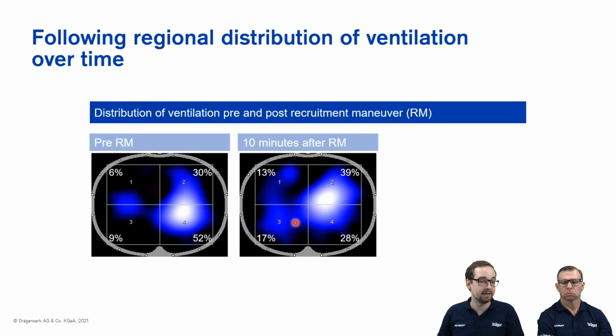And here we can see, yes, there's a positive response from here to here. There's more blue color in regions number 1 and 3, and also the percentage has increased. So this is a good indicator that we're looking at a positive response to this recruitment maneuver.